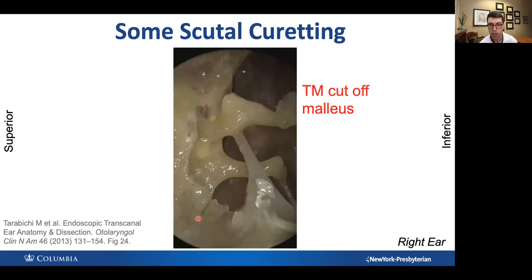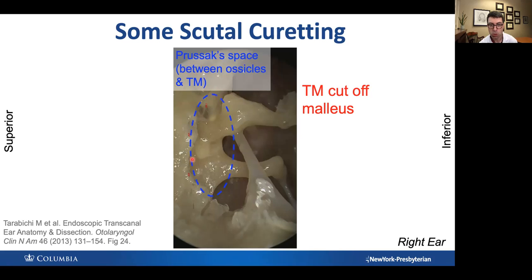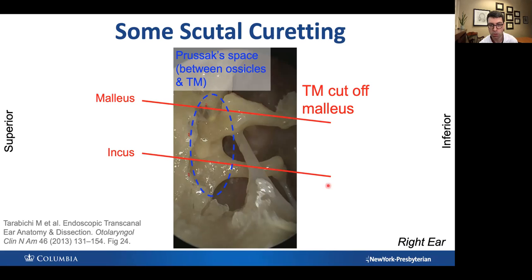Here's the lateral canal. If we cut the TM off the malleus and curet more, we can see even more detail of the ossicular mass — this is now cadaveric, not in situ. We see the incus over here, malleus over here, the chorda tympani nerve going in between. You can see the malleus, the incus head, the short process of the incus which is what you see when you do a mastoidectomy pointing at you like a nose pointing posteriorly. Prussak's space is basically the space between the ossicles, the epitympanum, and the eardrum — exposed here by having curetted the scutum. Another key thing: the malleus and incus are two parallel lines. The chorda tympani will always go lateral to the incus but medial to the malleus.